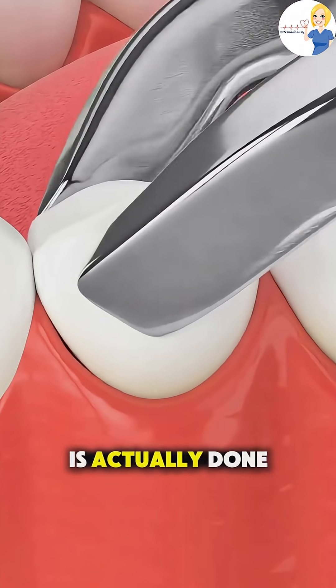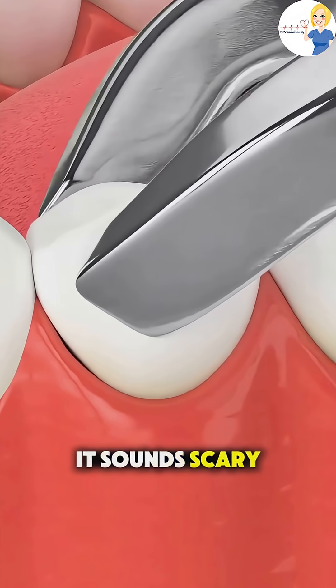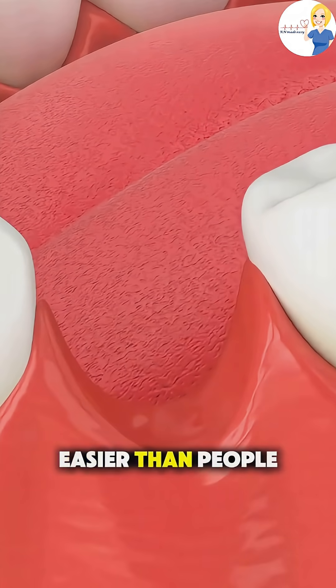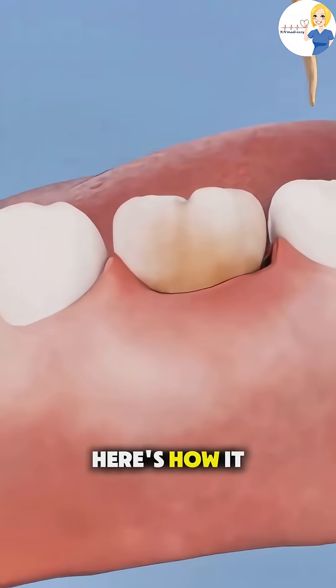Ever wonder how a tooth extraction is actually done? It sounds scary, but it's a quick and common dental procedure that's usually way easier than people think. Here's how it works.